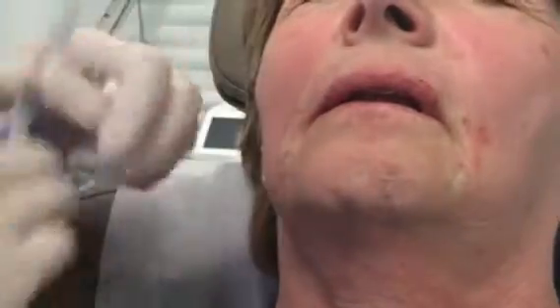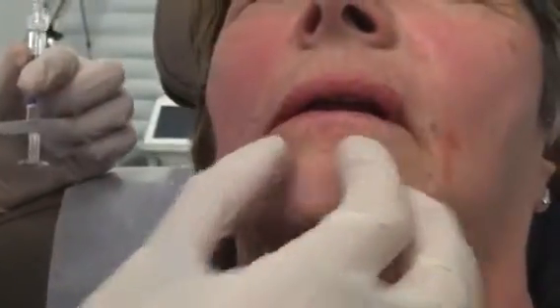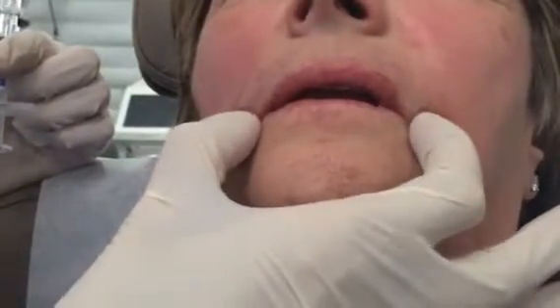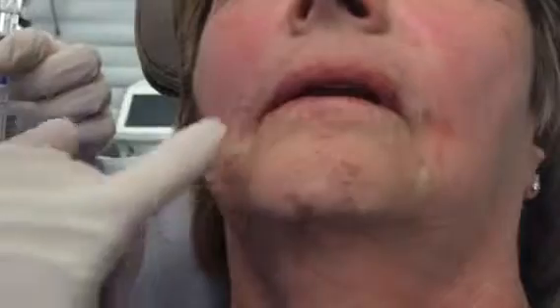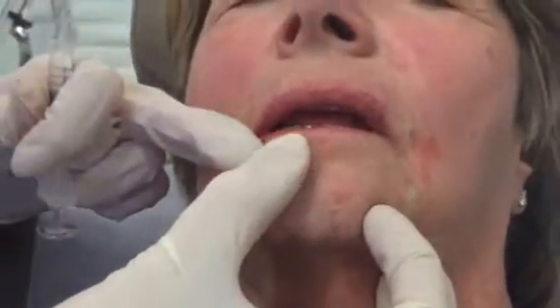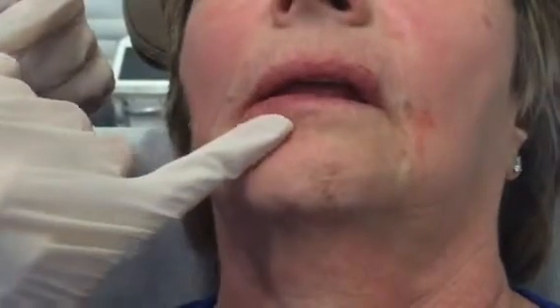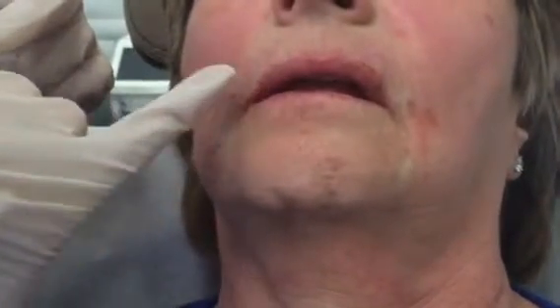And that's really pretty. You can see that helps just volumize this area. The last little things I'll do to finish up are the corners of the mouth — what we call the oral commissure — and then again between the wet and dry border of the red lip, filling a little bit so that the textural changes along the red lip start to smooth out and echo the upper lip. And so that's Restylane Silk.